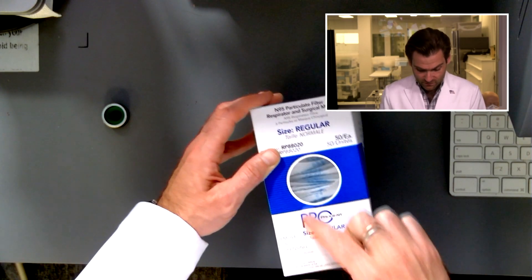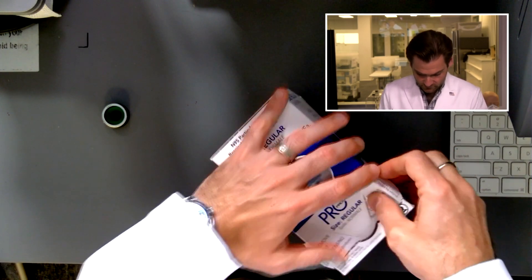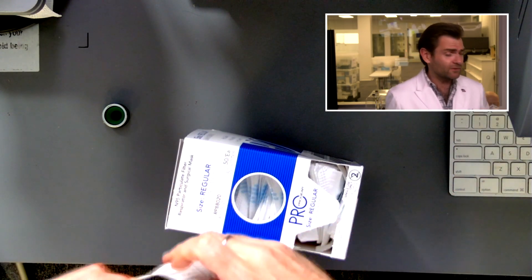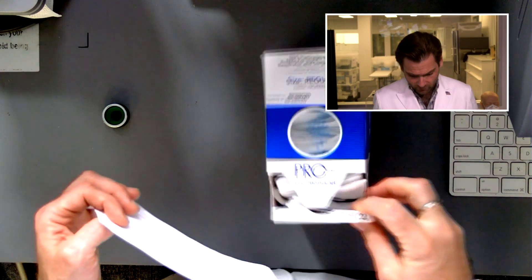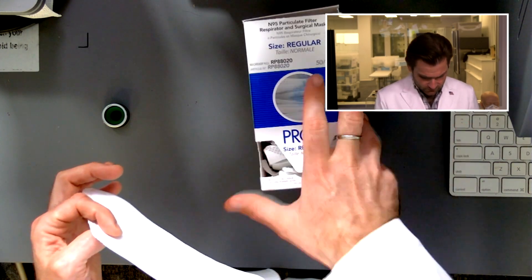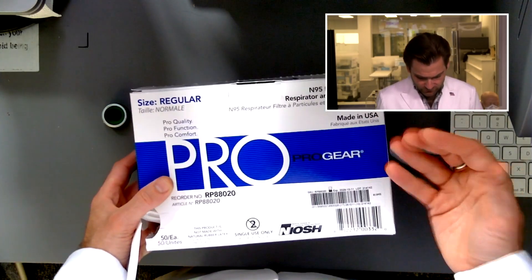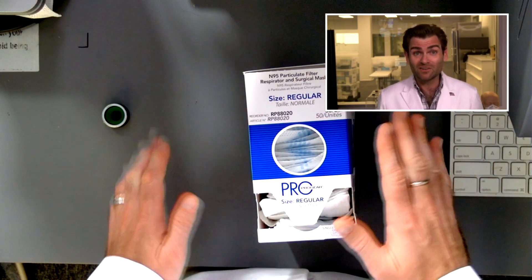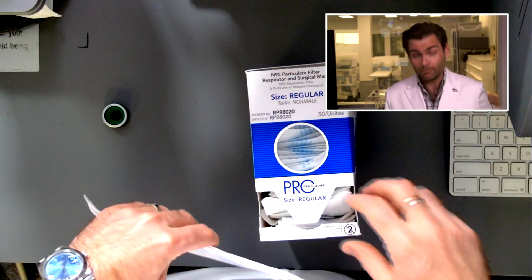I like the box because it's got this window here so you can see how many masks you have left. They also have this cool little dispenser deal — I've never used one before so I'm probably going to break it. This is made for hospitals; that's who these guys have been selling to for a long time — hospitals and governments. Bingo bango, you just take one right out, nice and easy. The box feels very substantial, and it should — while being one of the most breathable masks, it's also one of the more expensive ones you can buy.